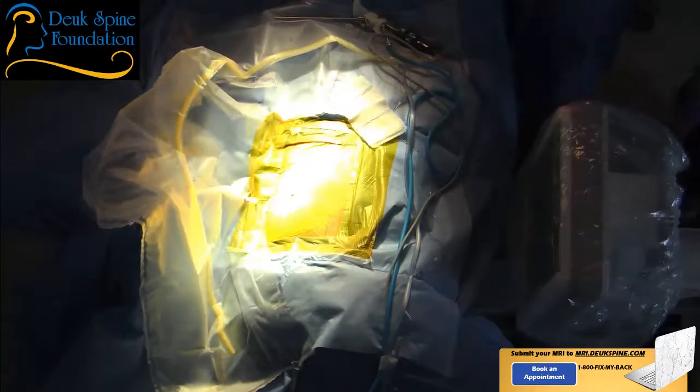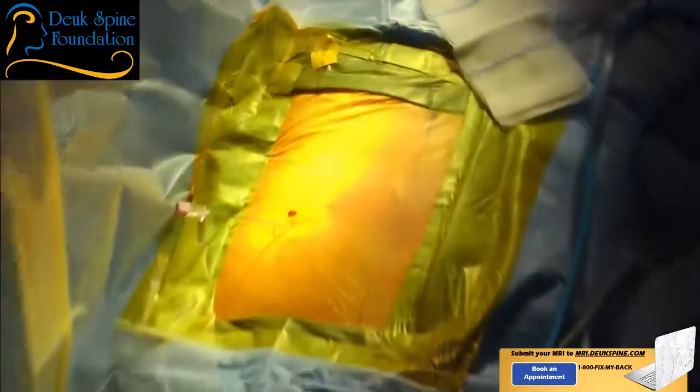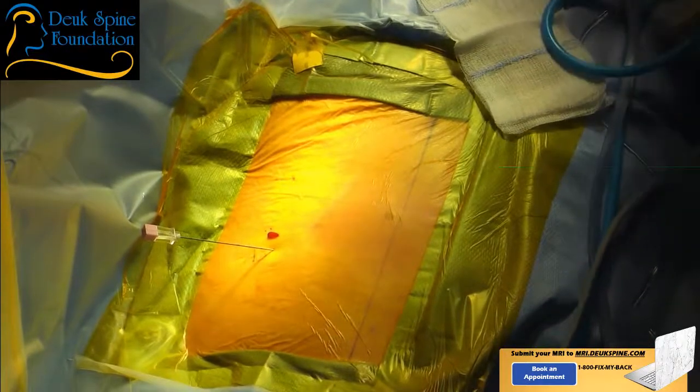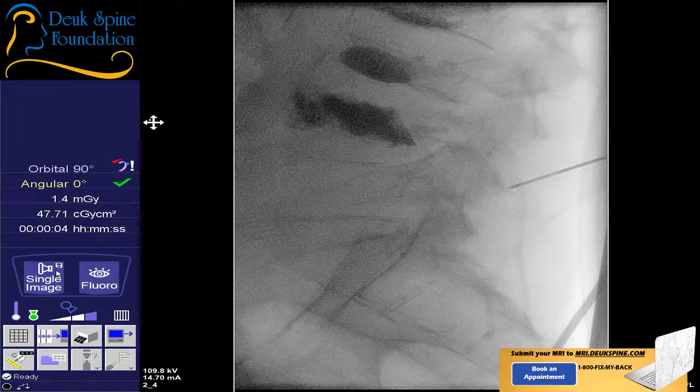So because he's so deconditioned, he spends most of his time, I think, wheelchair bound. He doesn't get a lot of activity. You can see the osteoporosis. The bones are just not strongly developed on the imaging, and that's because basically the bones are very thin.